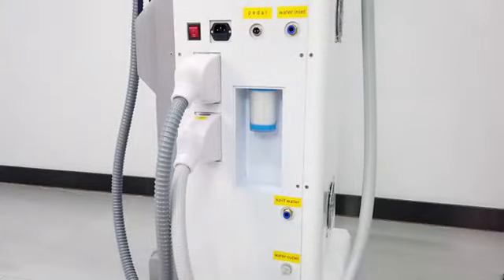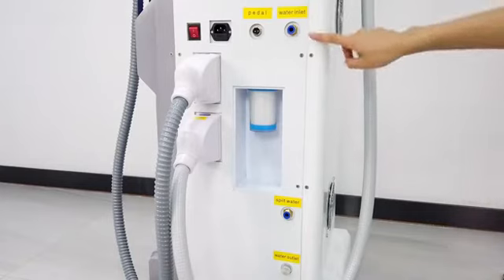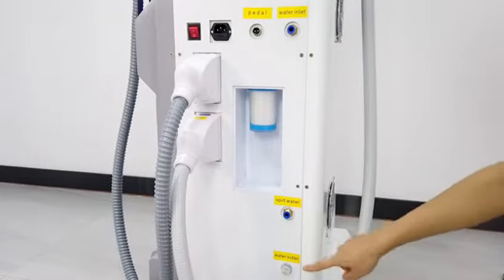When we see the machine, we install all the handles into the machine. And here has three holes: water inlet, spill water hole, and water outlet.